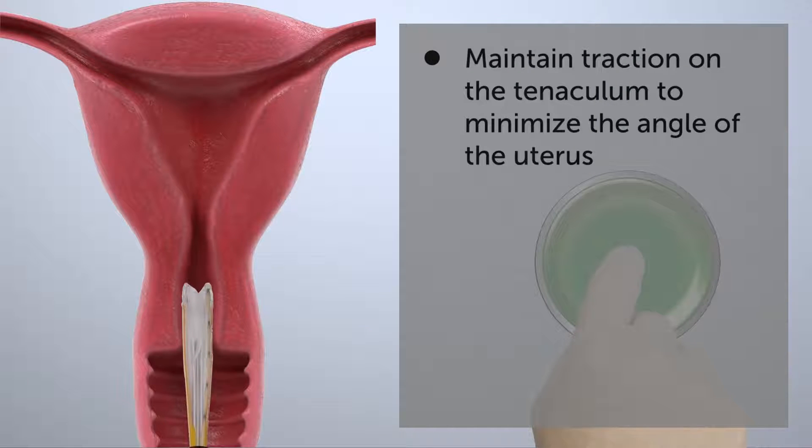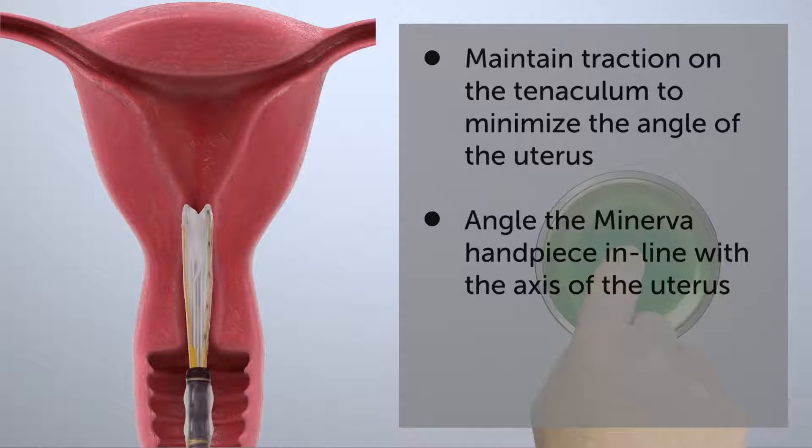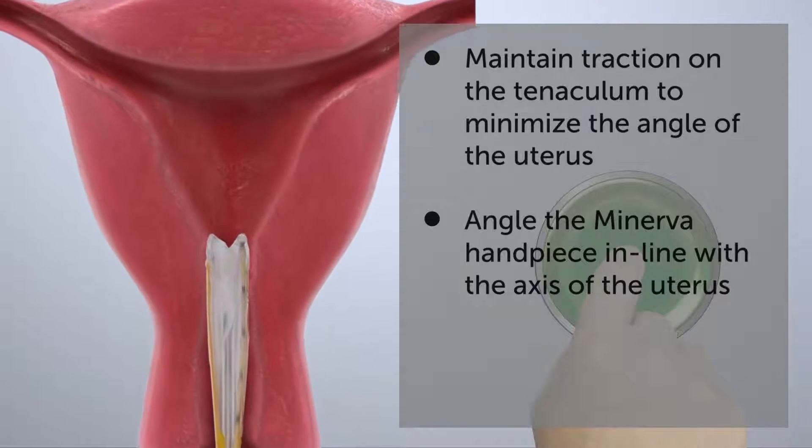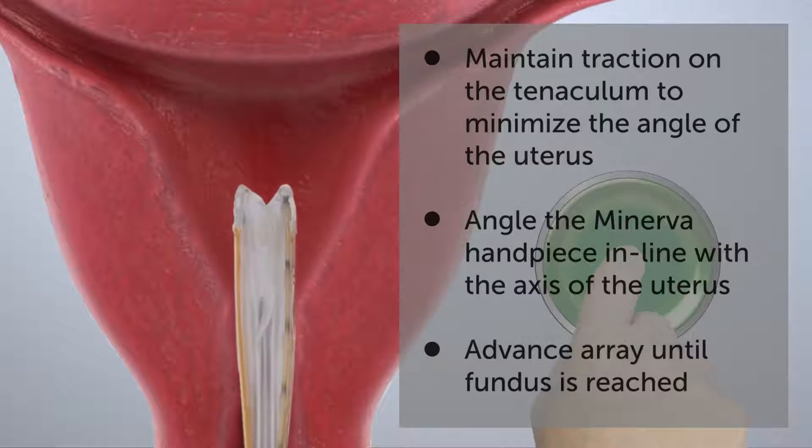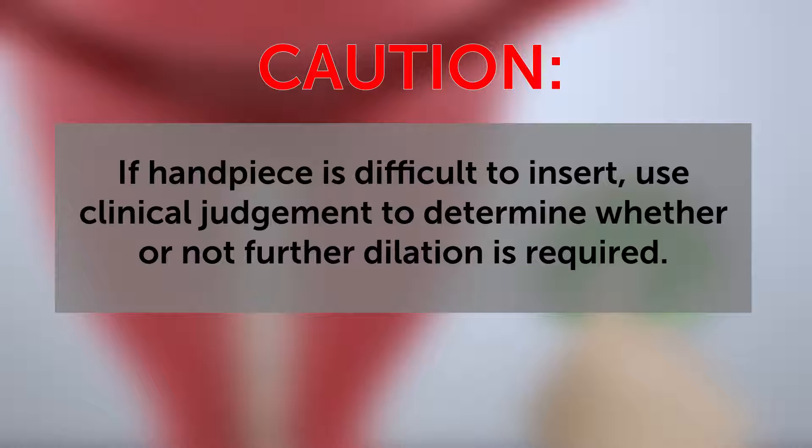Maintain slight traction on the tenaculum to minimize the angle of the uterus. Angle the Minerva handpiece in line with the axis of the uterus and advance it until the distal tip touches the fundus. If the Minerva handpiece is difficult to insert into the cervical canal, use clinical judgment to determine whether or not further dilation is required.